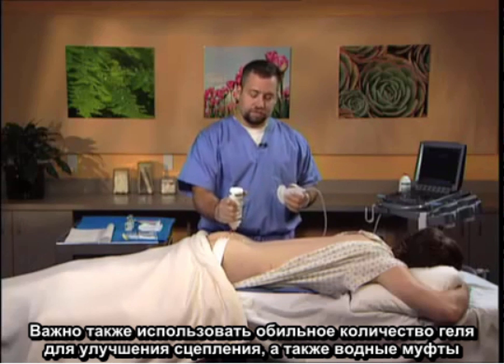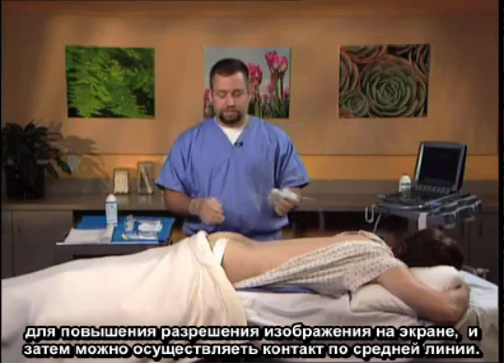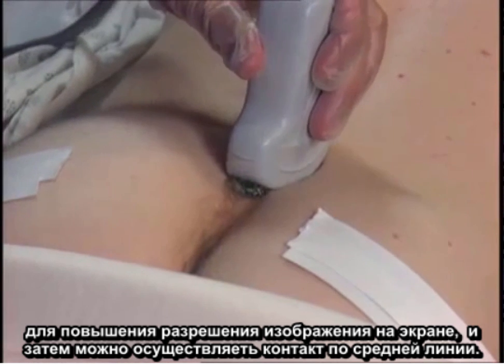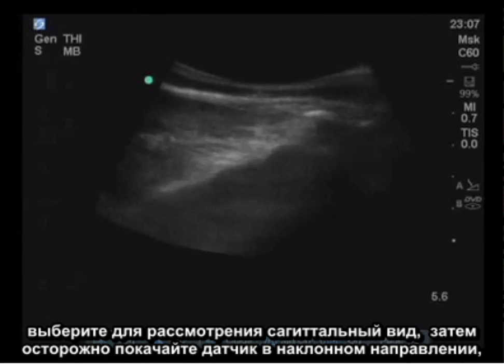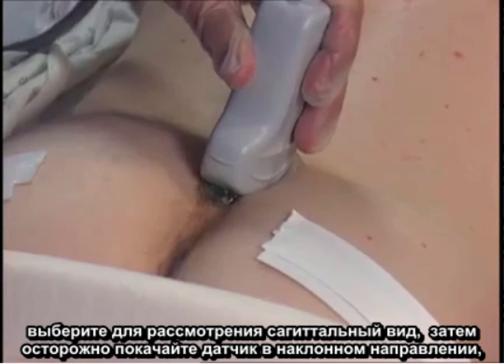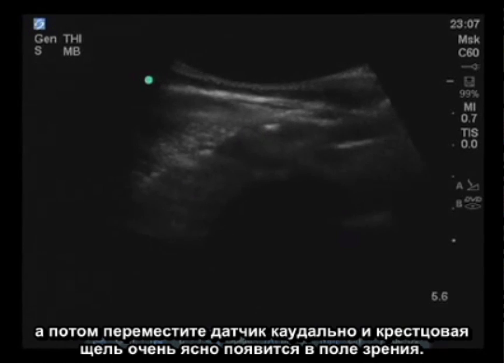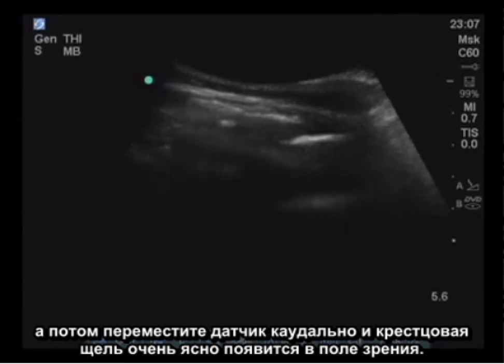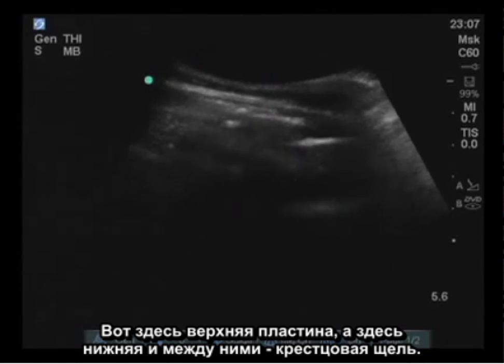Placement of a copious amount of gel for aqueous coupling is important to enhance resolution on the screen. Contact is made in the midline. Because there is anatomic variation in the midline physiologically, a sagittal view and then gently rocking the probe in the oblique direction can help find the spinous processes of the sacral space. The probe is then moved caudally, and very clearly the sacral hiatus comes into view — there is a superior plate and an inferior plate, and in between them is the sacral hiatus.